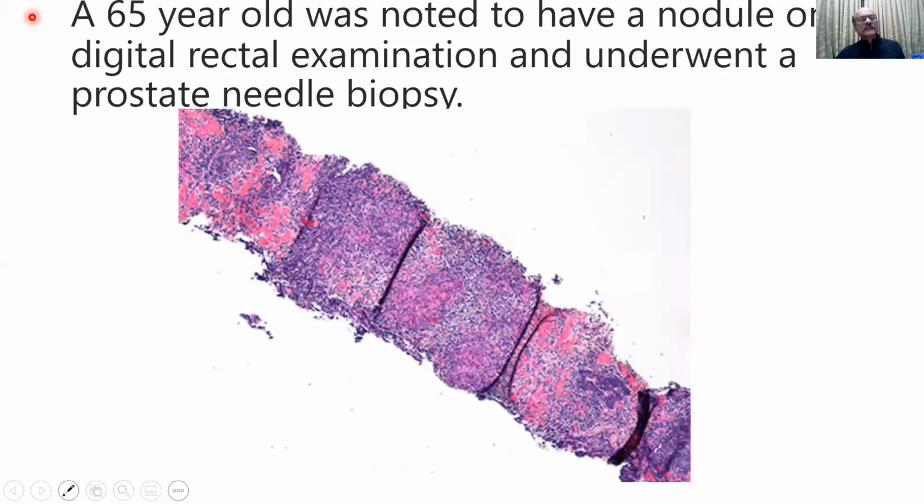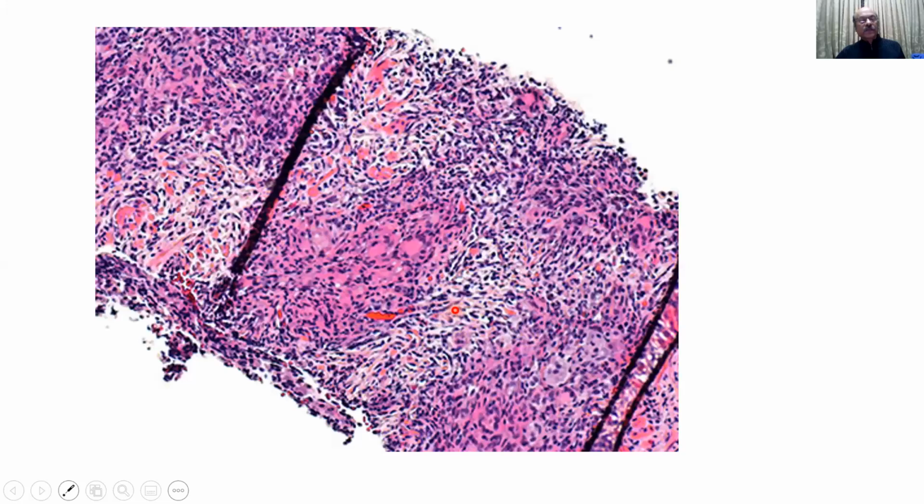Our next case is a 65-year-old man noted to have a nodule on digital rectal examination who underwent a prostate needle biopsy. Here, there is some sort of granuloma, and GMS.